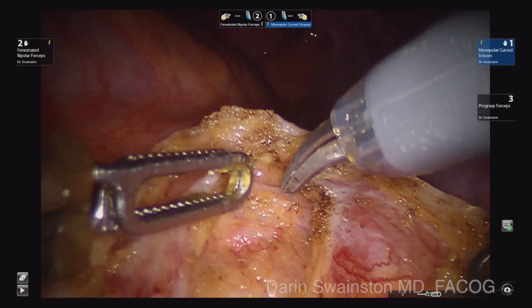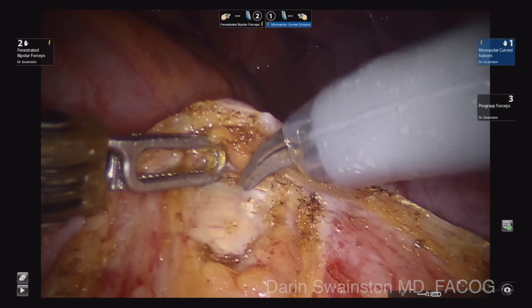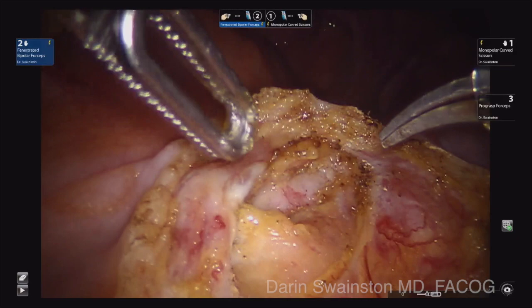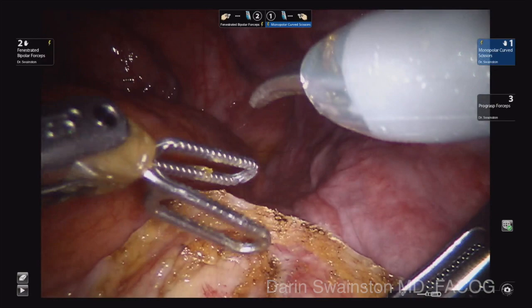That area right there is the money spot. I am going to gently open that up and will clearly start seeing the sacrum right there now. That ligament that sits right over the top — that is a good safe area to go. You want to make sure you have enough dissection here so it is not difficult to attach the mesh, but you do not have to skeletonize a huge area. You just need enough to be able to attach. That white area you see there is plenty well dissected — that is about all you need.